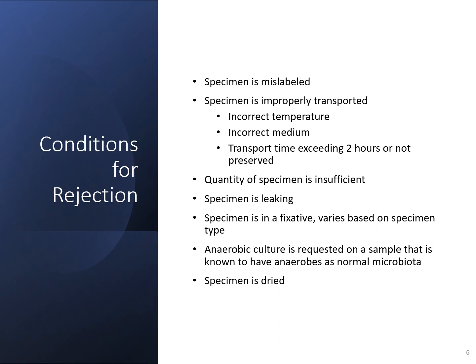But typically a specimen would be rejected if it's mislabeled, if it has the wrong patient's name on it. Those would be rejected and need to be recollected.